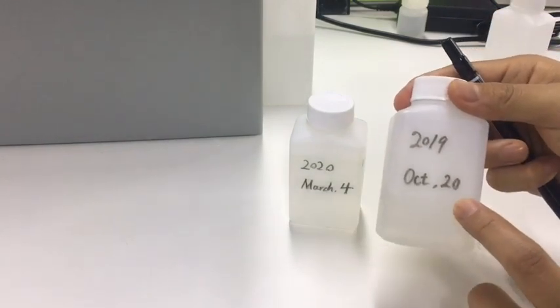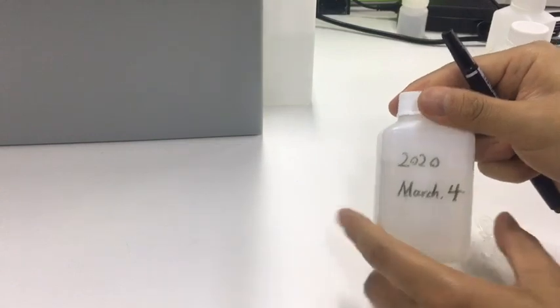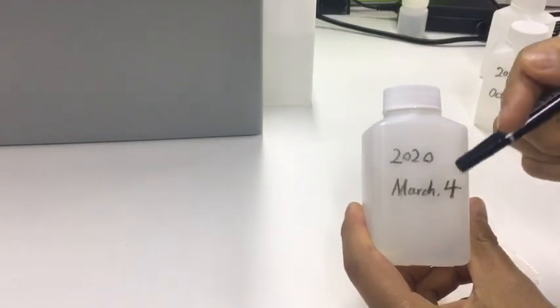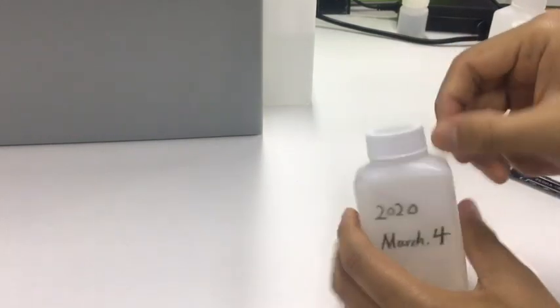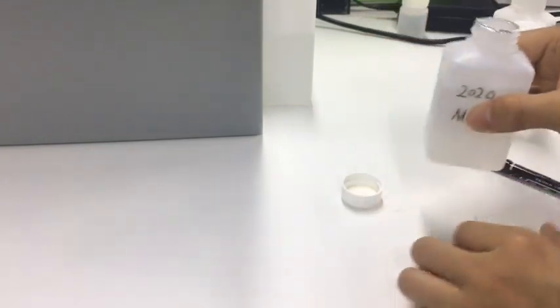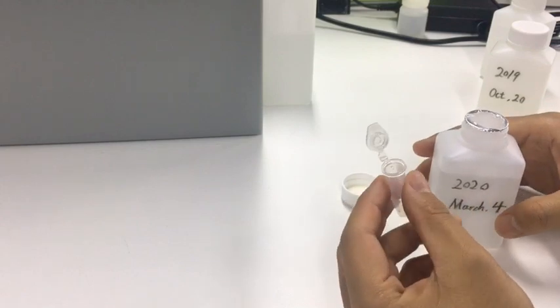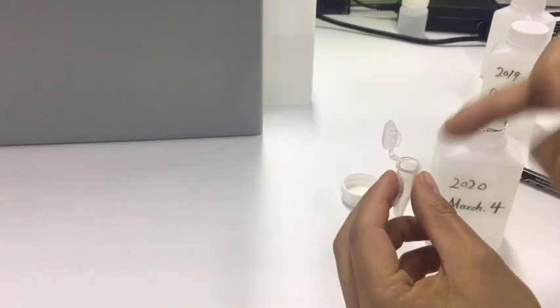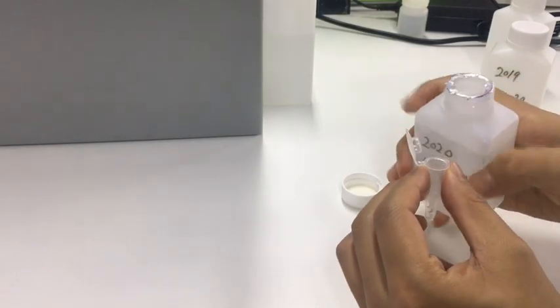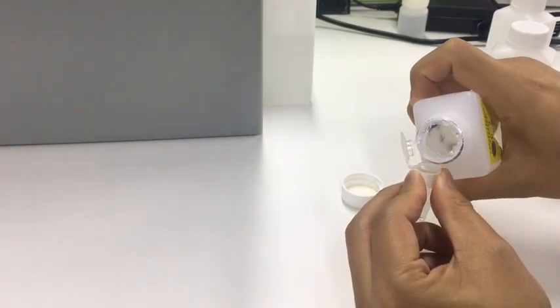This one is already invalid, so we use a new one. This one is opened today. We use a bullet tube to take some solution and prepare for using later. You can use a bullet tube or other small containers to take the solution.